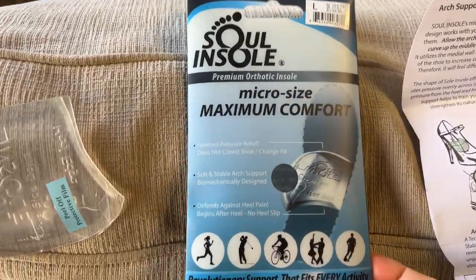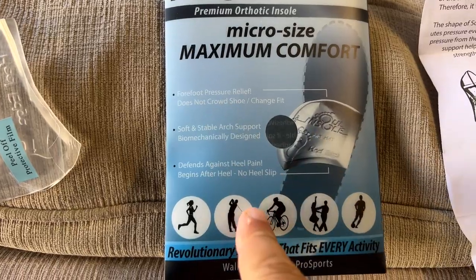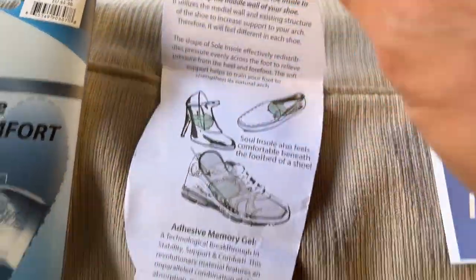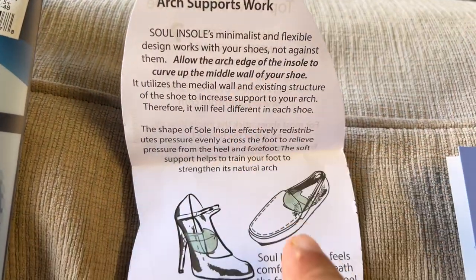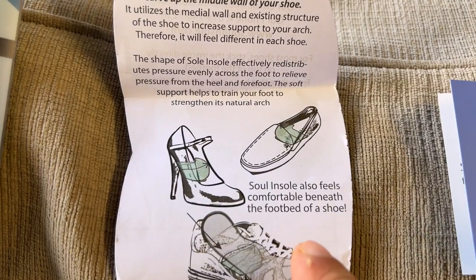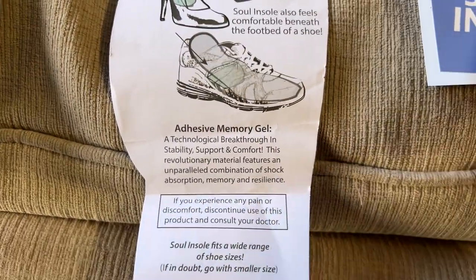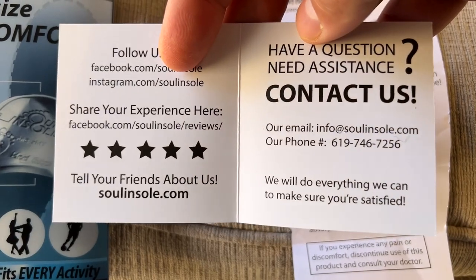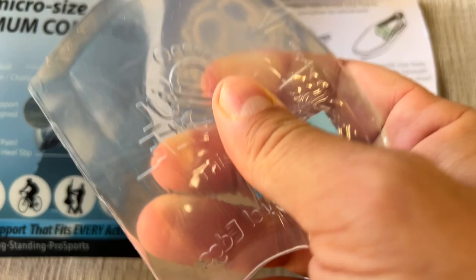I just got these new Sole insoles. I have plantar fasciitis and this company is really cool. Look at this — it comes out like this and shows you how the sole works, where to put it inside each type of different shoe with a nice picture. It comes with a handy guide and a contact card if there are any problems. I love the personal touch and the user experience.